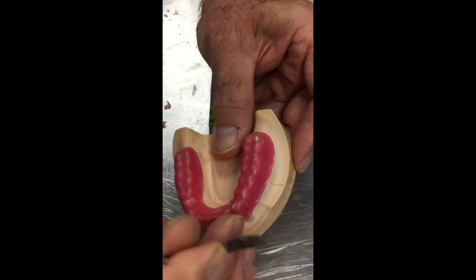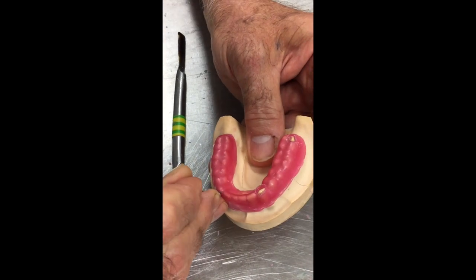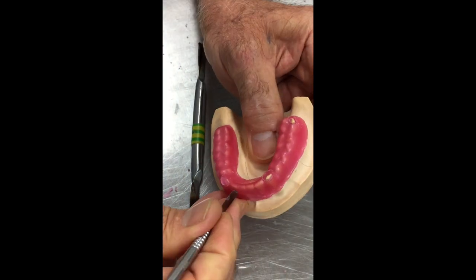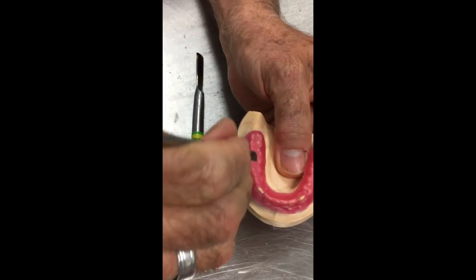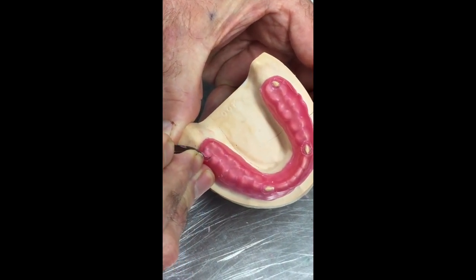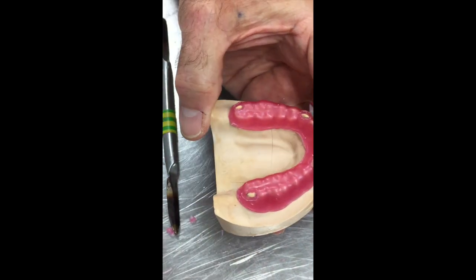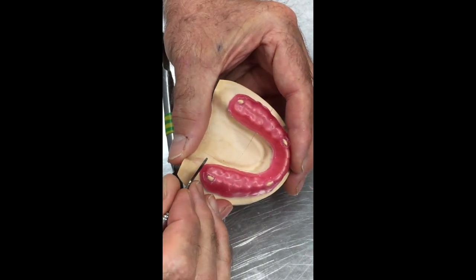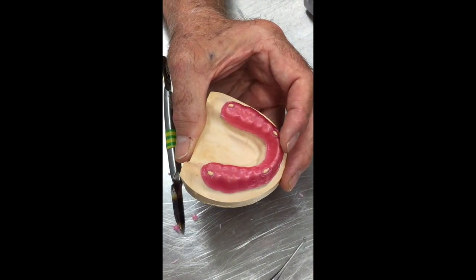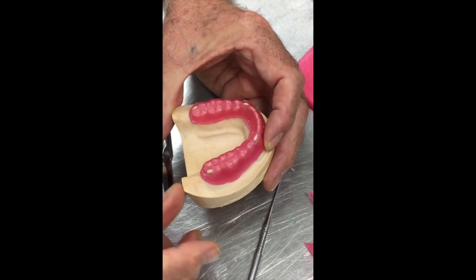Okay, so resist laying this over on an angle. We're cutting it just vertically down like so, and our tray material will go down and touch the tooth. Don't be scared to make these cover the whole of that cusp. Too often we see beautifully constructed trays that have a pinpoint contact with the tooth, which must be awfully difficult for the practitioner to seat accurately in the mouth, at that stage where the patient's had their mouth open for an hour and they're keen to get out of the surgery. We want to make sure that this process is seamless and efficient and all done in one case. So there we have the tissue stops. This tray is going to seat on those nicely and it'll be a very positive fit.